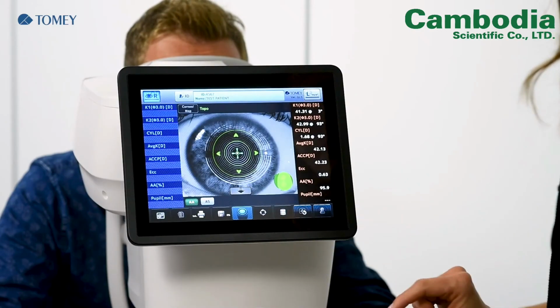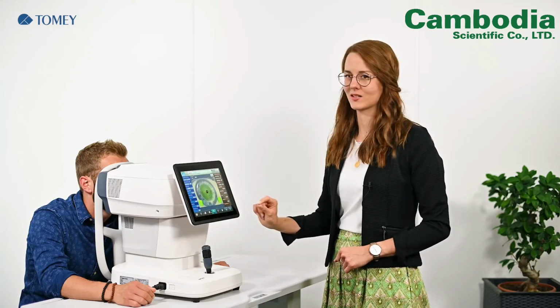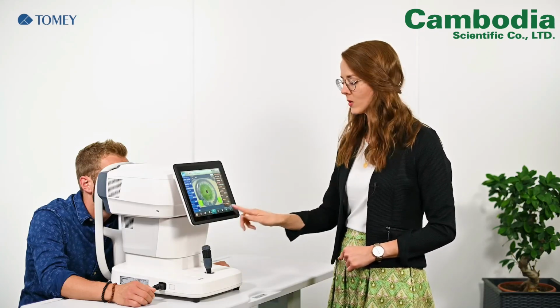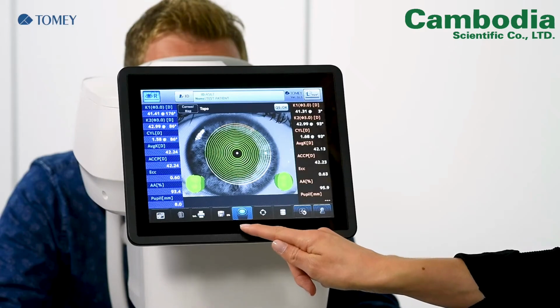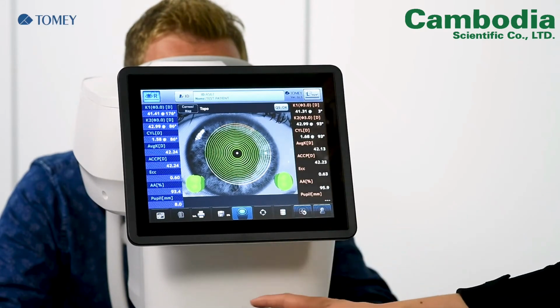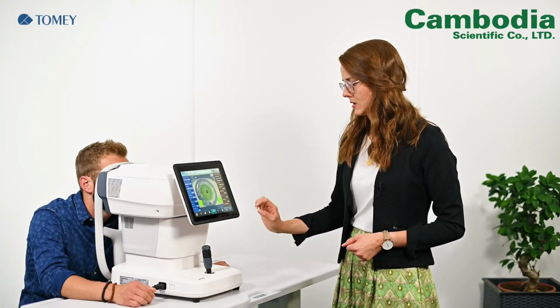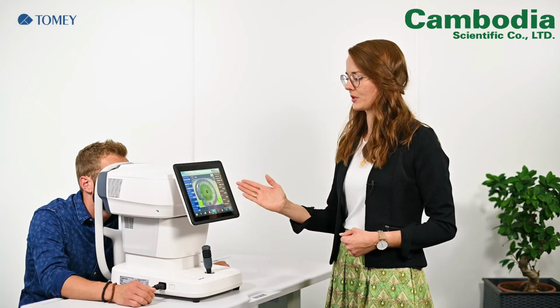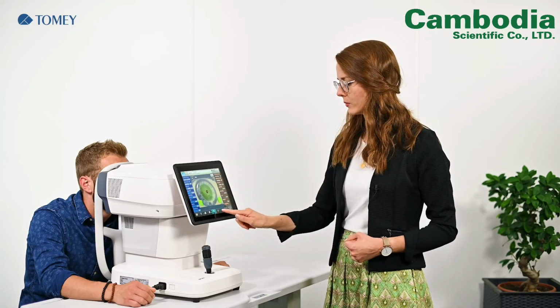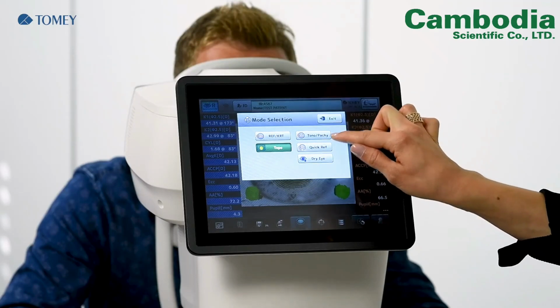And keep open. As you have seen, you can activate the measurement by touching the auto shot button or the examination button, which is in the display. Or another possibility would be using the measurement button on top of the joystick. Okay. So now the topography is finished and we change to the Tono and Pachy mode.